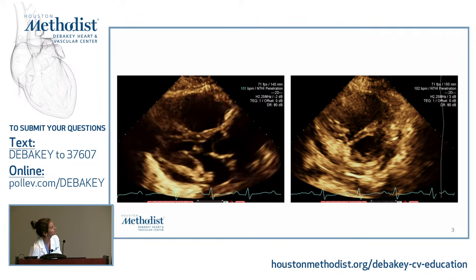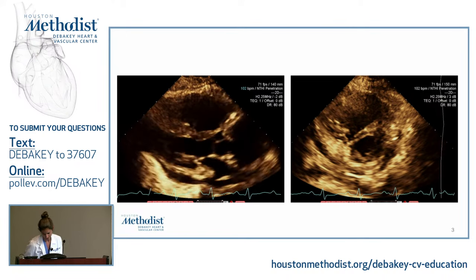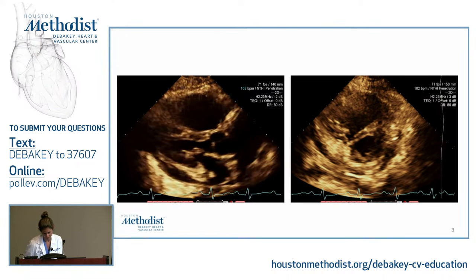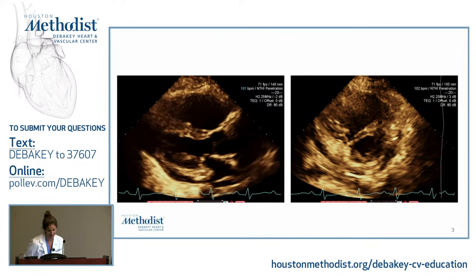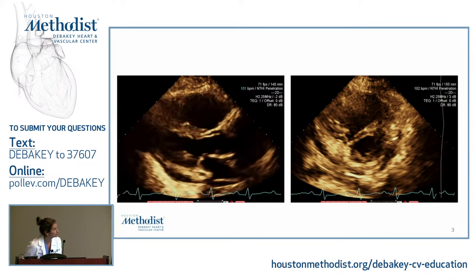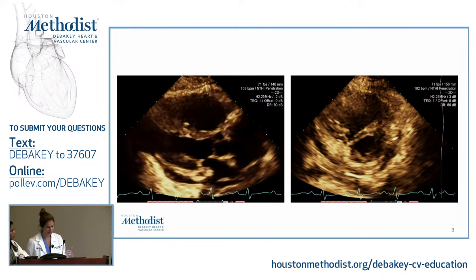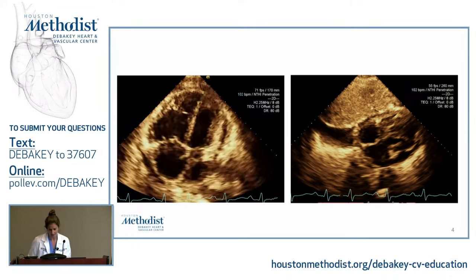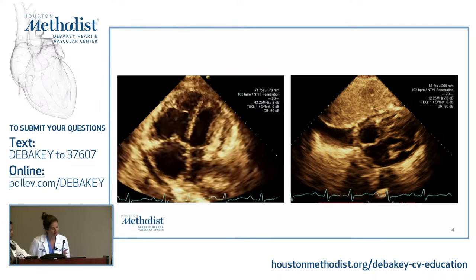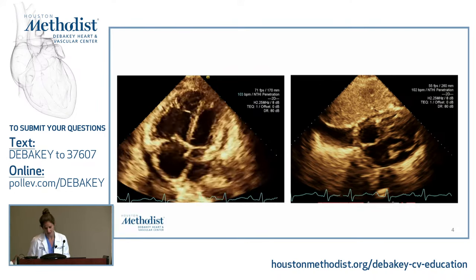Massive, yeah. Posterior, I see a posterior pericardial effusion as well. The LV is contracted okay-ish. I think it's okay, but the RV is not. Yeah, exactly. So RV is huge, which is somewhat to be expected in a patient with pulmonary hypertension or longstanding right-sided filling pressures, maybe not quite this large. But yeah, we are seeing that LV, significant diastolic collapse, indicating very, very high pericardial pressures.